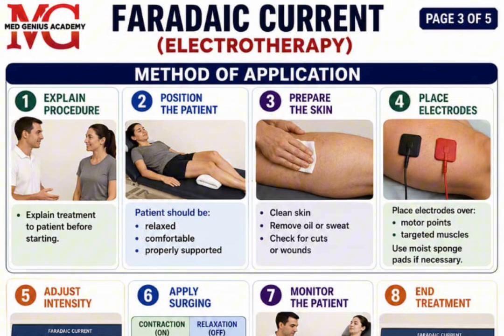Just to keep a good legal standpoint. Are you getting it now? It is just to keep a good legal standpoint, because as a medic or as a therapist, you have to make sure the patient is aware of the risks, the usefulness, and the disadvantages of the procedure. You have to tell the patient, and you have to explain each step to the patient.